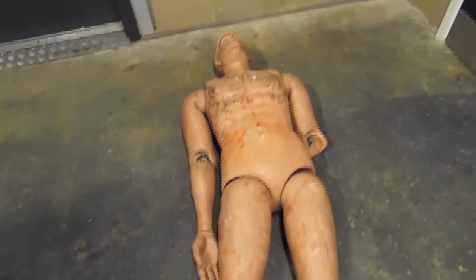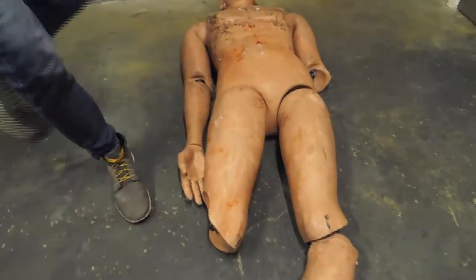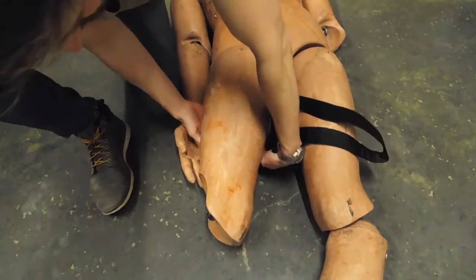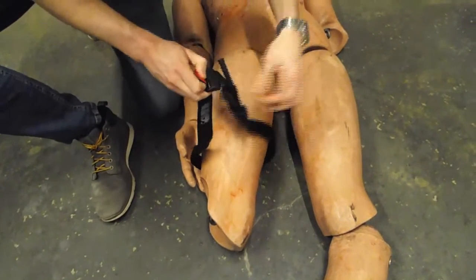Here we have a training mannequin with a traumatic amputation to the right leg. To apply the CAT, start by unravelling it fully. Now wrap it around the affected limb, making sure you are above the wound site at the nearest viable tissue to the wound site.